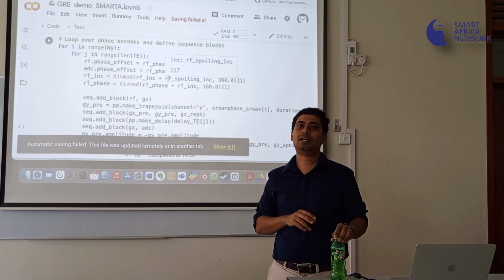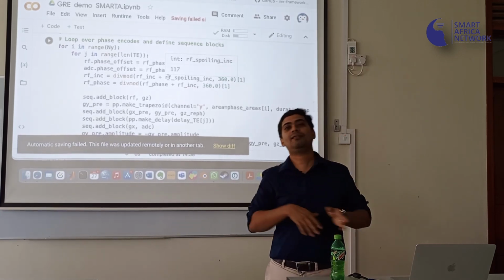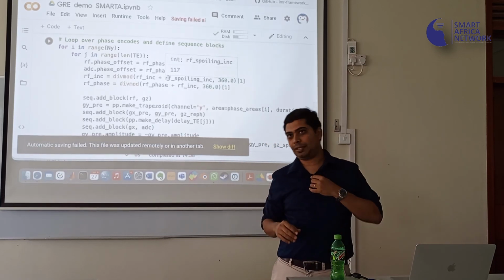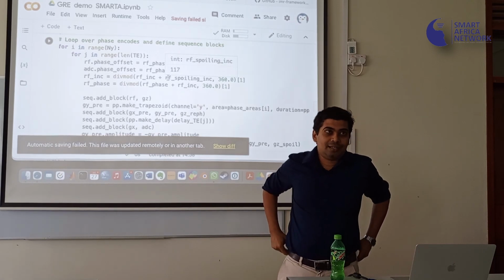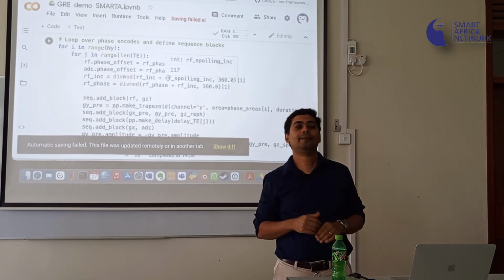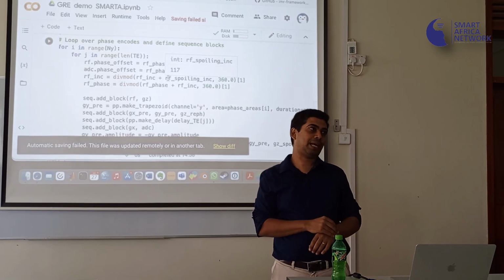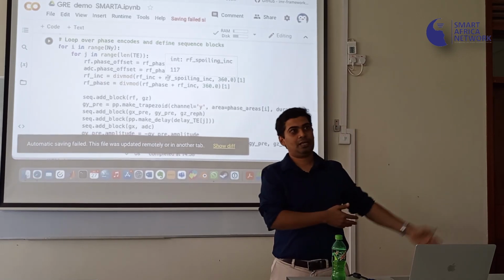Of course, you can figure out also based on frequency filters whether it falls in the red wavelength or the green wavelength or the blue wavelength. So that's optical imaging. In MRI, we do things a little differently. We don't directly capture the photons from the object. It so happens that we end up capturing the Fourier transform of the object.